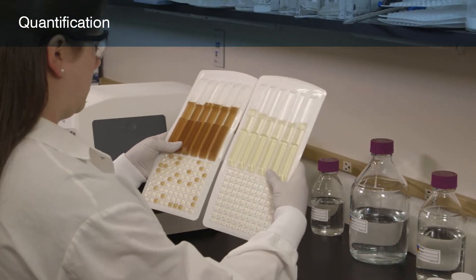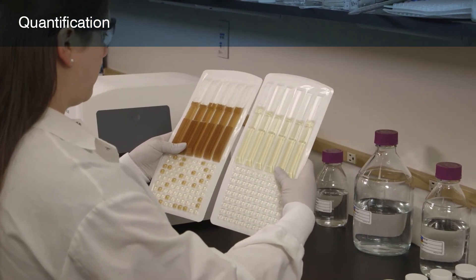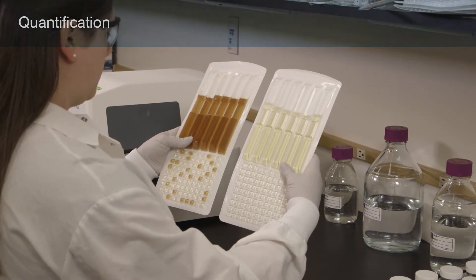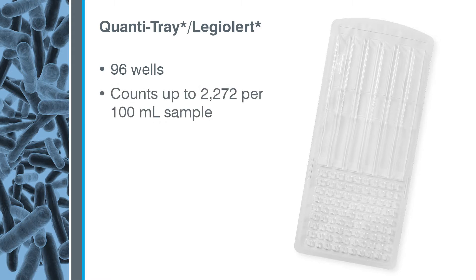In the next few minutes, we will demonstrate how to use the LegiAlert test with the Quantitray LegiAlert system to determine the number of Legionella pneumophila in a 100 ml potable water sample. The Quantitray LegiAlert is a disposable 96-well tray that provides counts up to 2,272 per 100 ml sample without dilutions.